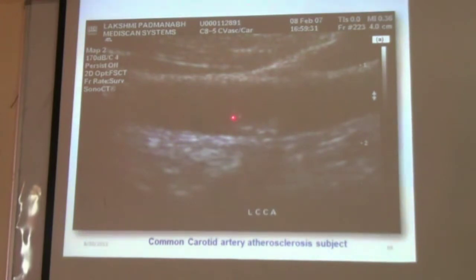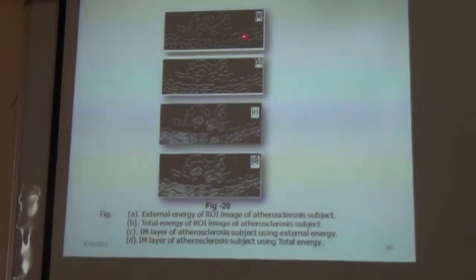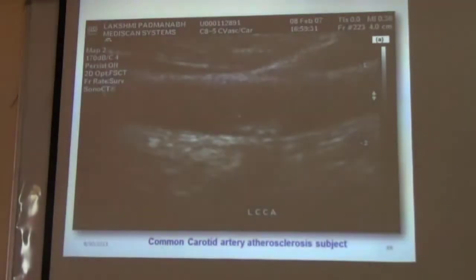Okay, so this is a cursor which is located in that automated ultrasound machine, but in our algorithm again you have to keep a vertex of it, and SRAD active contour is performed in this one. See that one, how wonderful this technique is, perfectly segmented and matching that one. Okay, but in atherosclerosis and all, you couldn't measure that intima media thickness. Where there is intima, where there is adventitia, it is tough. Clear? While seeing the picture itself, it's very clear.